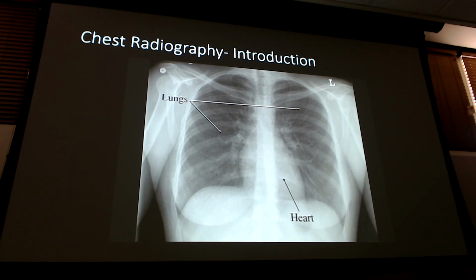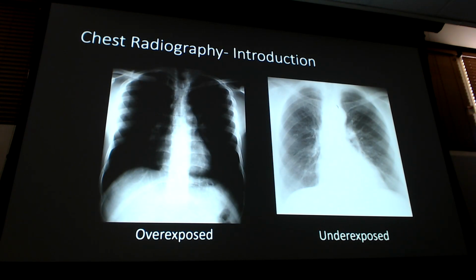On top of that, look at my spine. I can make out each of the vertebrae. I'm not asking you to count them, but I'm just telling you that I can make out each of the vertebrae on the thoracic spine. That tells me it's properly exposed. I have my pulmonary vasculature with my vertebral bodies. This is a good x-ray versus those. Questions on that so far? Okay.